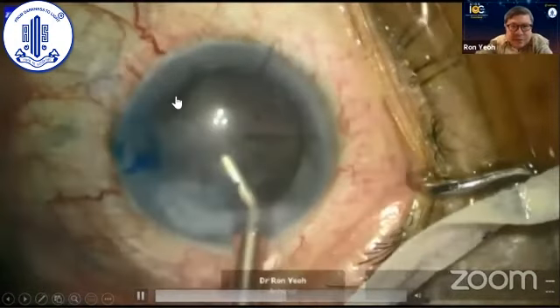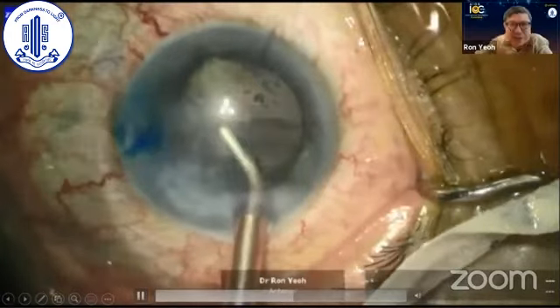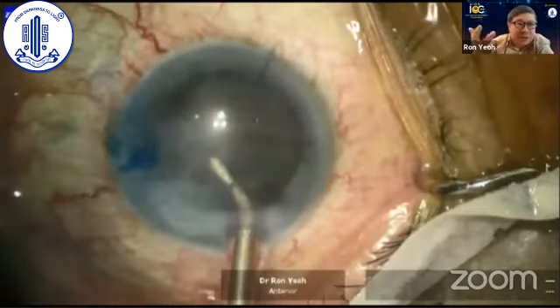Now, Donald's sitting with me because he's looking at the cornea. And then he said, I think that's just a wrinkle. I think it's a PCR. Donald says, no, I think it's a crease line in the posterior capsule. I said, well, let's turn on the OCT and see.